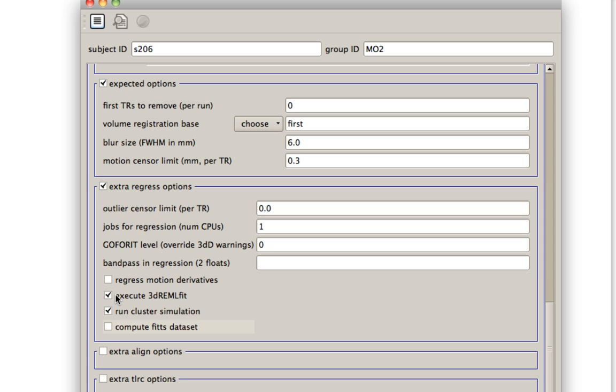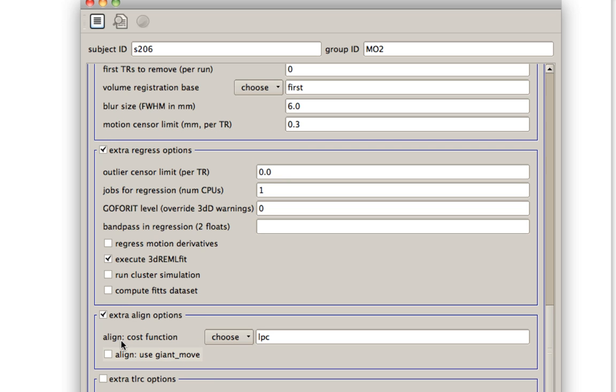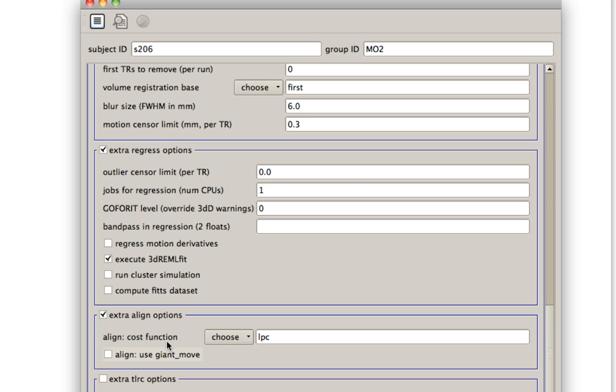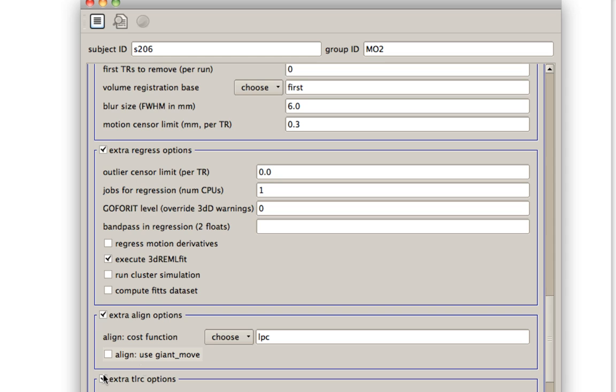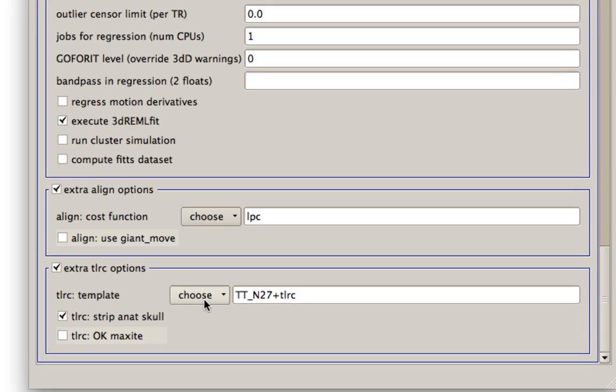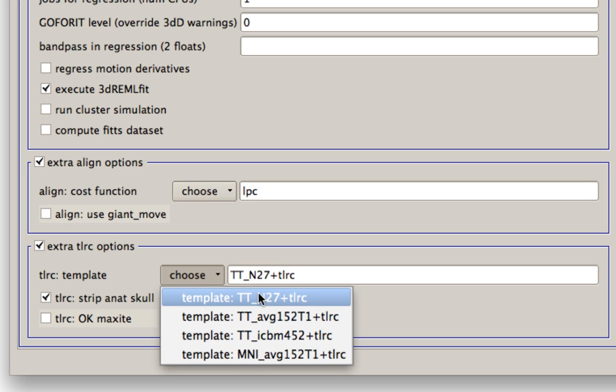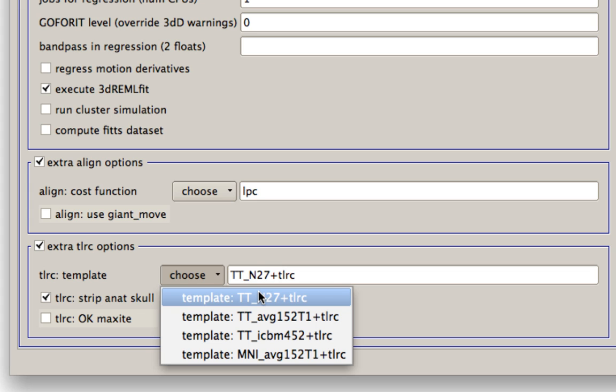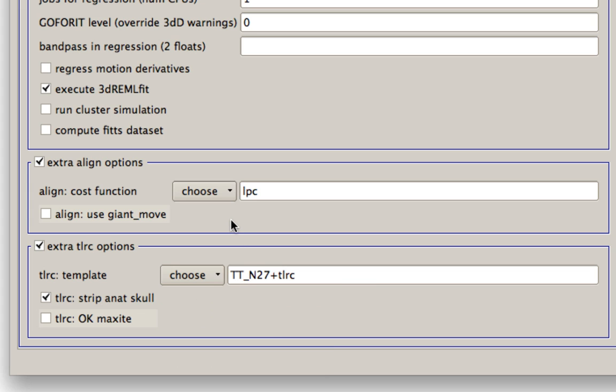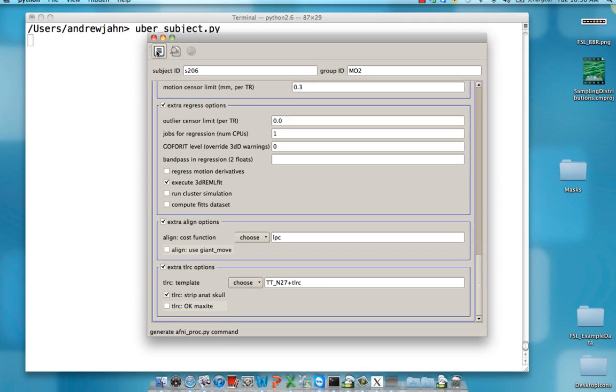So more options here. For example, maybe I want to run 3dREMLfit. Maybe I don't want to run cluster simulations and so on. The alignment options are usually good as a default. You can read about this more in one of the recent AFNI papers detailing their 3dAllineate and cost functions. Lastly, for Talairach and warping options, you can choose different datasets to warp to. You have a few different templates that you can choose. There's MNI and there's Talairach.